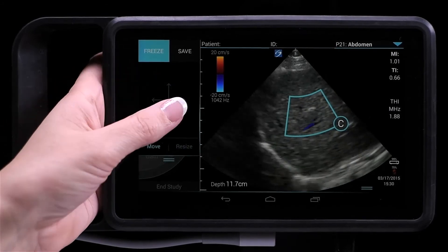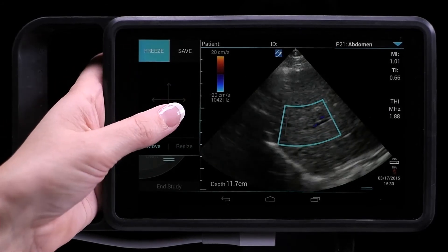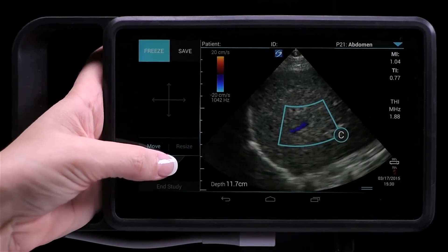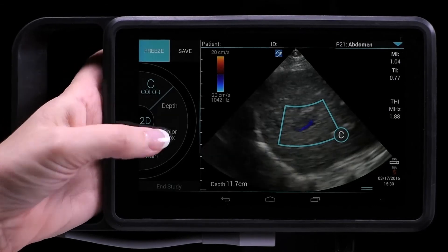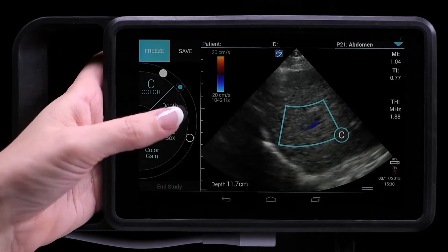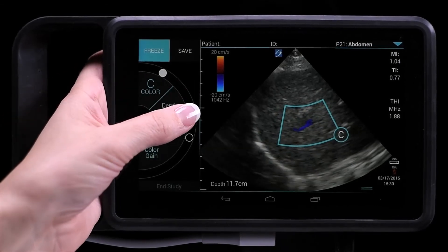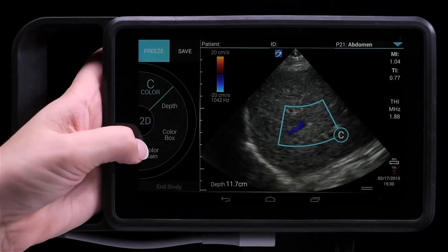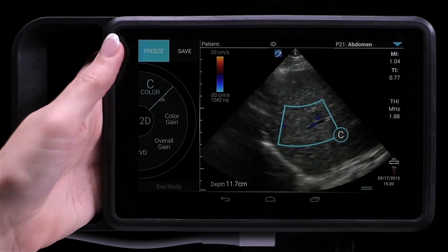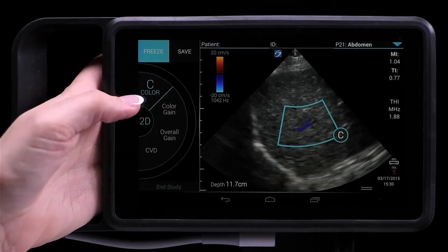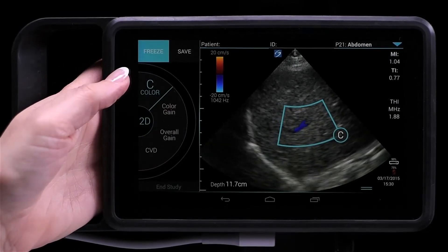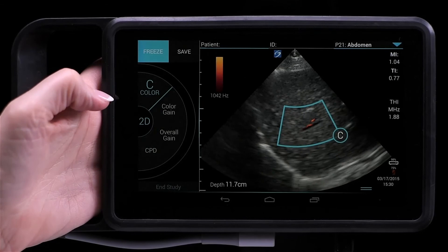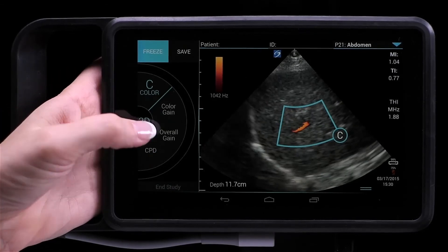You can also adjust placement, color gain, scale, and flow, as well as switch between color velocity Doppler and color power Doppler.